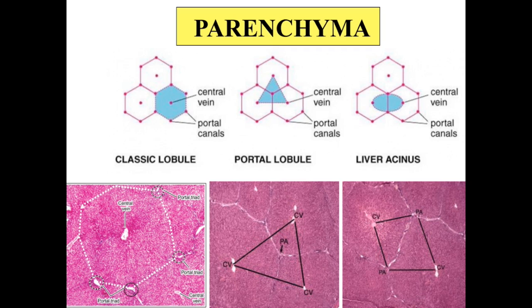The liver acinus is a mass of liver tissue surrounding a central vascular core. This is the central vascular core. This core is formed by branches arising at right angle from hepatic artery and portal vein. So this vascular core is formed by branches arising at right angle from the branches of hepatic artery and branches of portal vein present at the portal tract or canal.